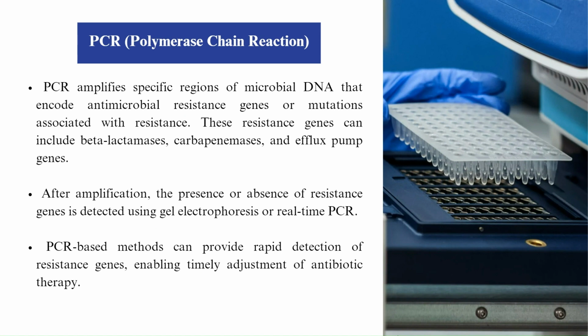These resistance genes can include beta-lactamases, carbapenemases, and efflux pump genes. After amplification, the presence or absence of resistance genes is detected using gel electrophoresis or real-time PCR. PCR-based methods can provide rapid detection of resistance genes, enabling timely adjustment of antibiotic therapy.